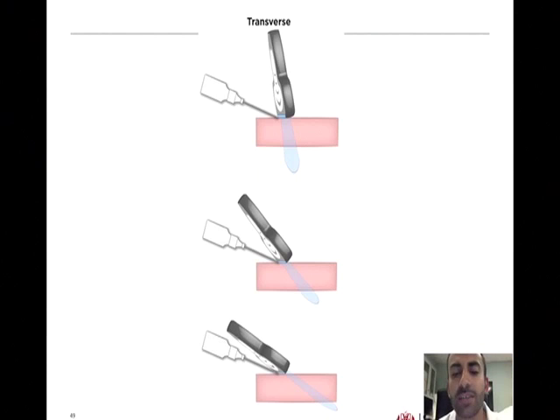Key concept that I want to try to demonstrate, that idea of always imagining the ultrasound plane, is from the common vascular access or regional anesthesia. Anytime we're doing needle-based procedures, right, we're always trying to identify the needle with the ultrasound plane. In this fashion here, I just want to show how as the needle is progressing, we are trying to adjust our ultrasound plane so that we capture that.